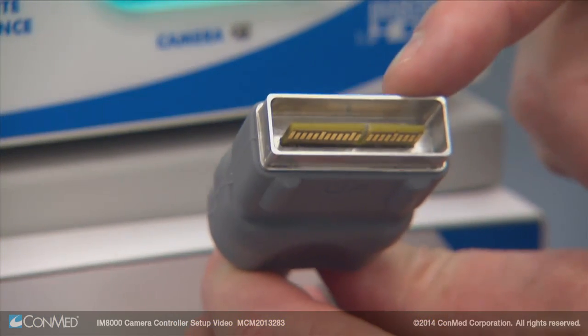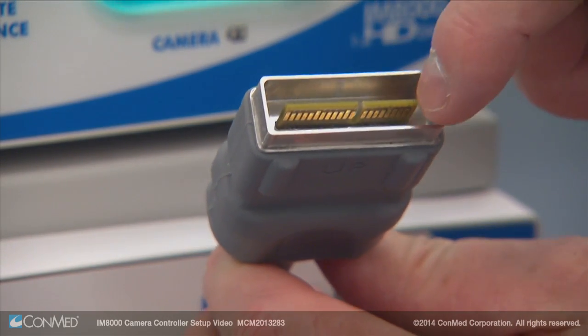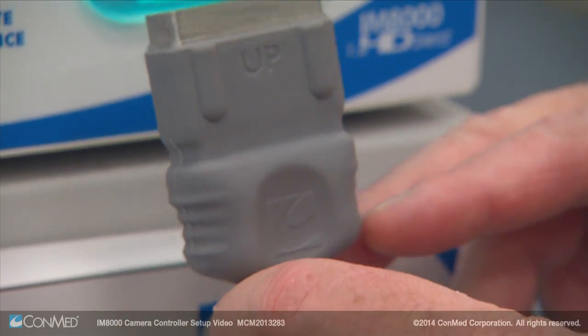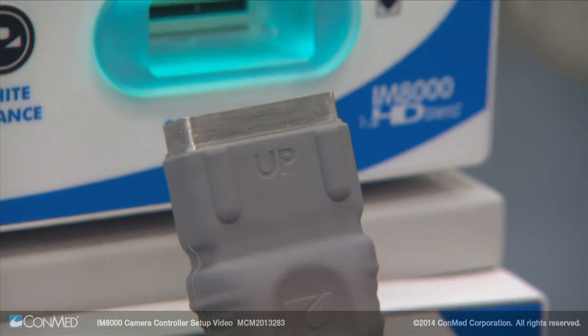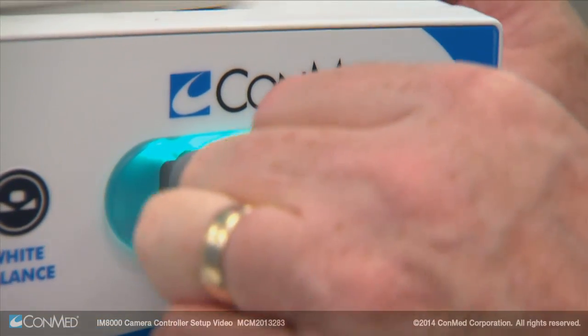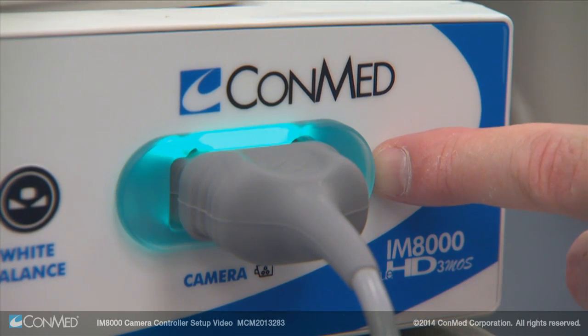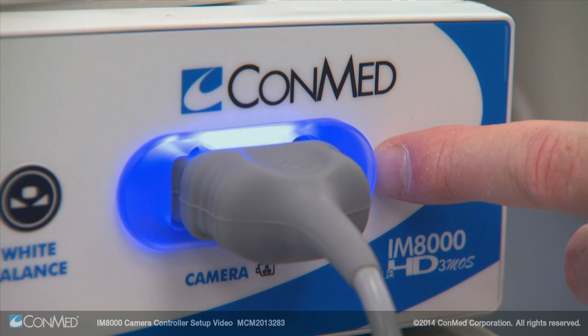The camera head must be inserted to access other menus. The camera head connection includes a shield to prevent electromagnetic interference and protect the card edge. Make sure the connector is aligned properly and insert it in the green-lit camera connector. It will flash green and blue and then remain blue once the connection is established.